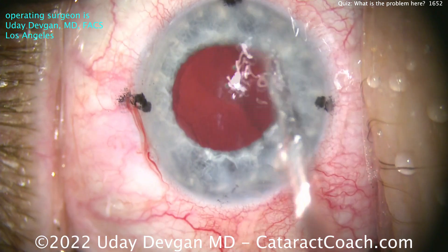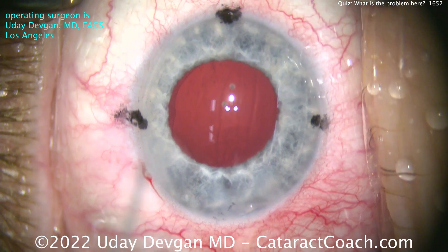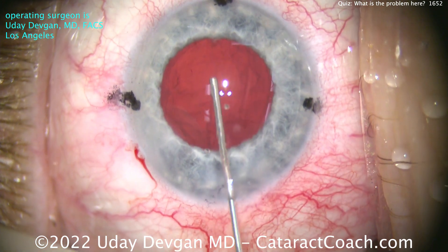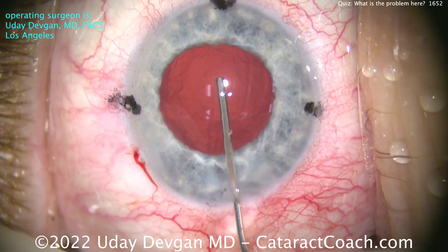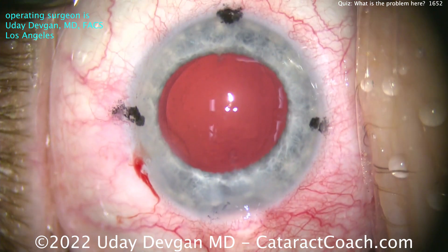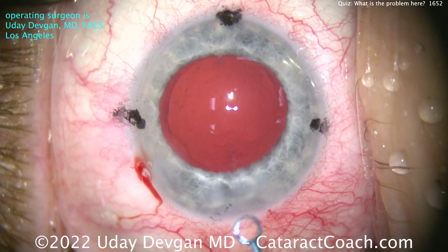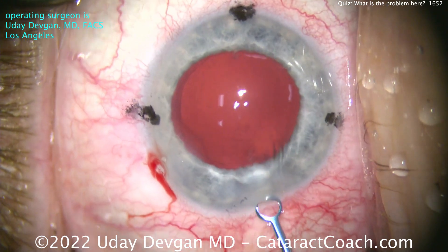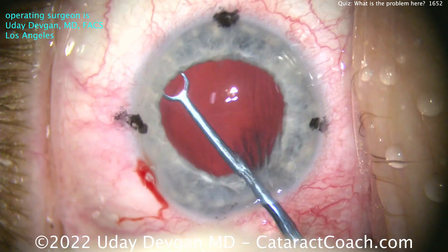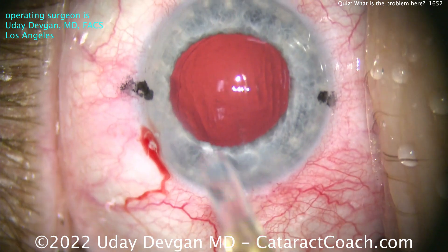Cleaning up the capsular bag — it looks very nice and clean, fully intact, the rhexis is round and intact. We're going to fill the capsular bag. Watch carefully — here comes the cohesive viscoelastic, nice good fill, beautifully done. A perfect rhexis. Zonular support is great, capsule is intact. Let's do a little capsule polishing — not a whole lot needed, but there was something that caught my eye.